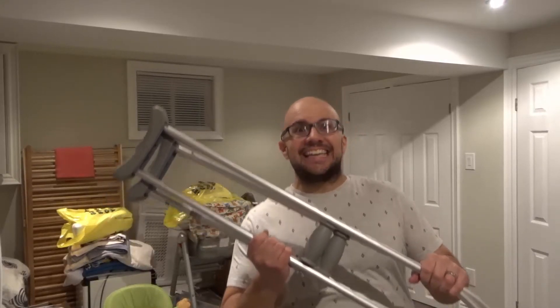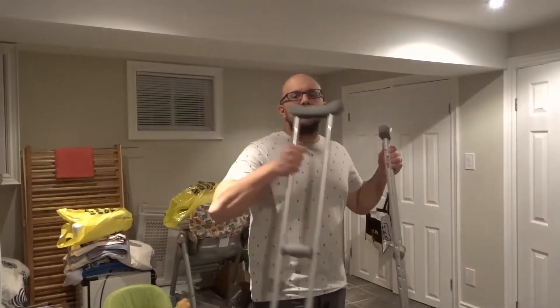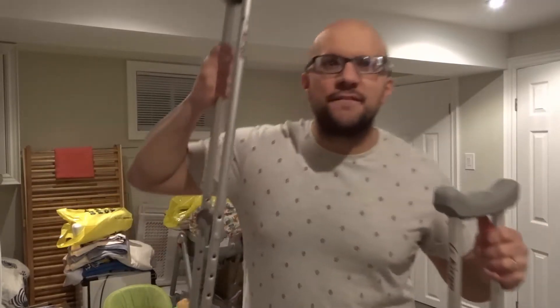Hey everybody! I'm here today to show you how to use crutches properly. This will be a full tutorial, so let's get right into it. As you can see, I have a pair of crutches and I'm going to show you how to use them easily, properly, completely and fully.